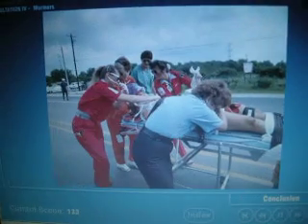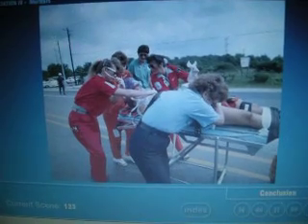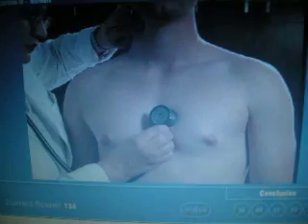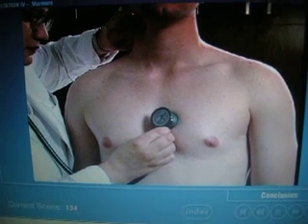In practice, things are not always so simple, and you may have difficulty even hearing many sounds in practice. This is when good hearing and listening techniques are crucial. Moreover, there may be extra sounds and murmurs and rapid heart rates. This is where routine carotid palpation is crucial.